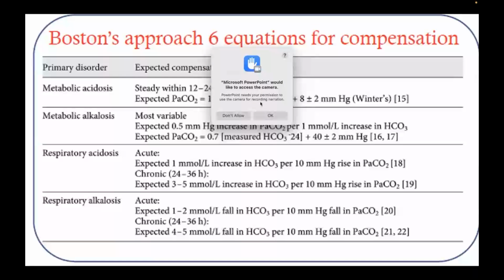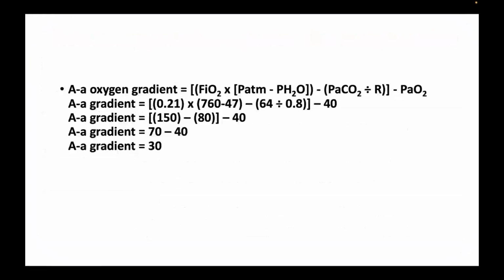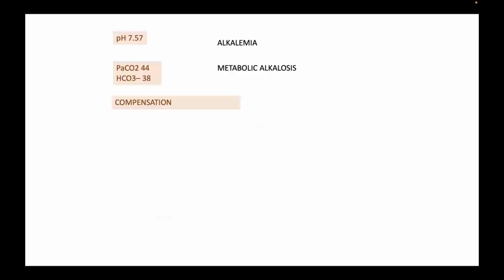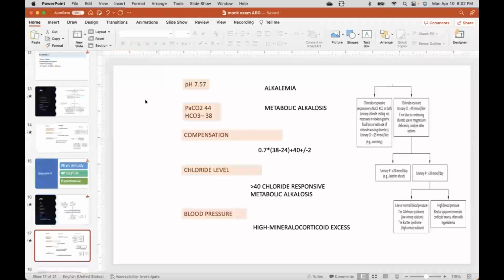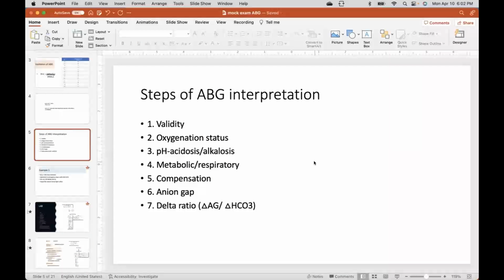Okay. If you don't mind, let's go through the first slide where you had the steps given, Rajvardhan. We'll just show that once, the way you read the ABG. For all practical purposes, for those who joined late, the steps of ABG: make sure that it is a valid ABG.